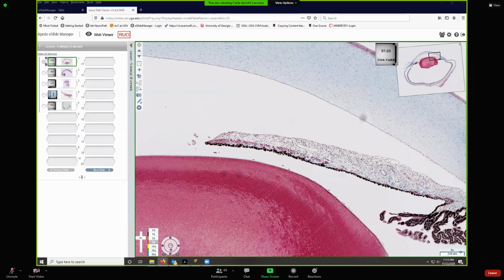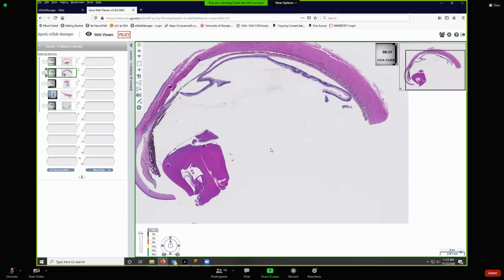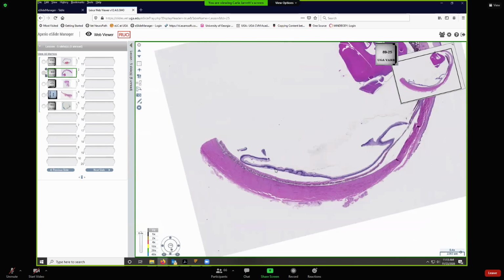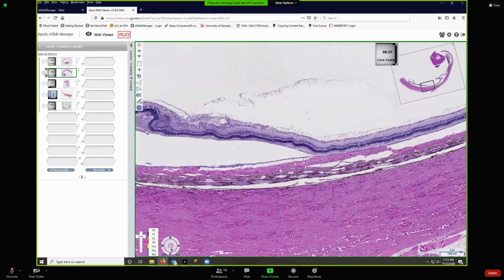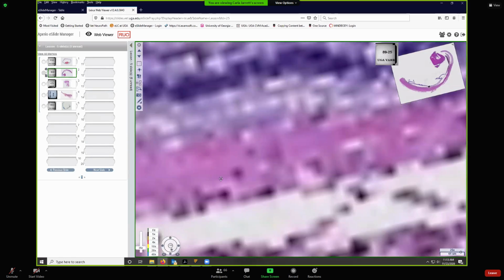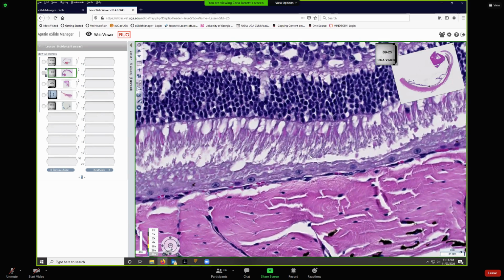And let's see, there was a question about, could you ID rods versus cones? That was to see if you understand how we name rods and cones, and have you looked at them, and can you ID them? There were pictures of them in your lab notes where we actually used oil immersion to show them to you. So this is a good one, the herbivore section.